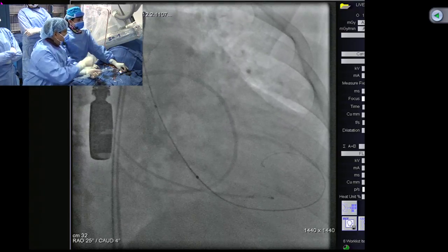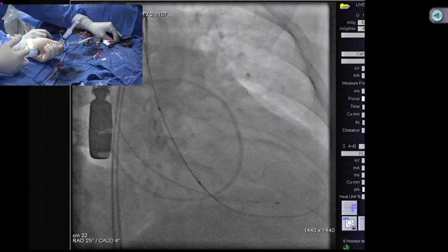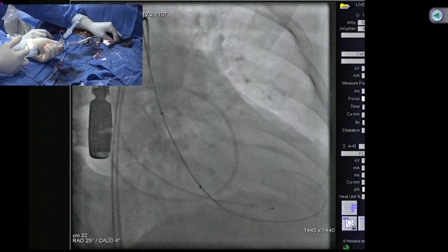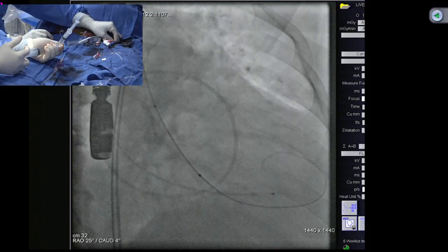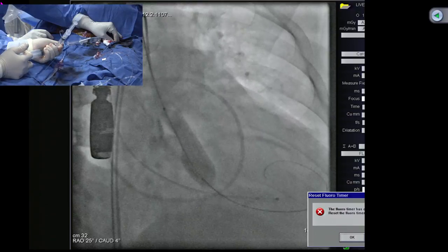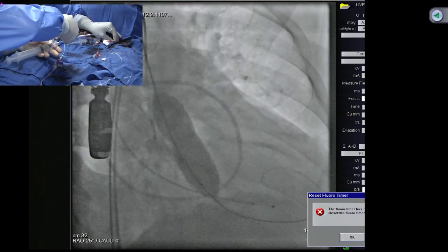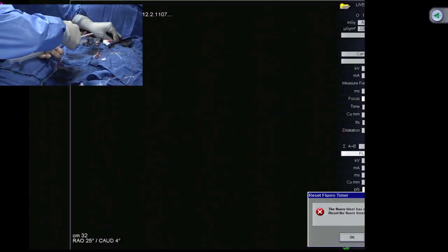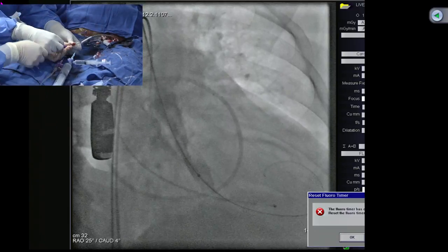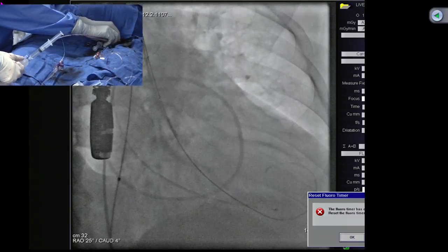Okay, having said that, go with the pacemaker. The pacemaker going 180. Sometimes 180 may be too fast, you go to 160, you have better capture. It's not capturing. Okay, it's good. Go. See, that chunk of calcium did not open. That's fine. We will not go more than that. No, we have to. I think it will. Okay, go back to the regular pacemaker off.